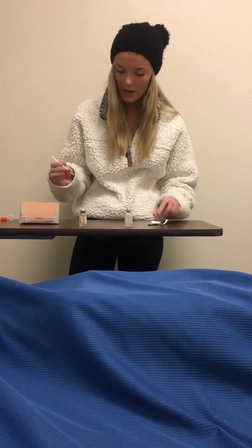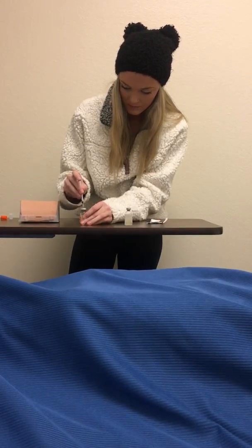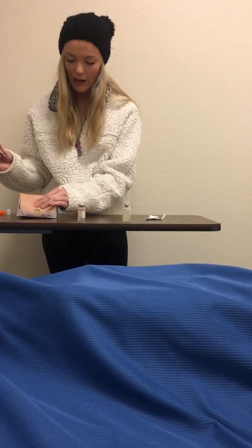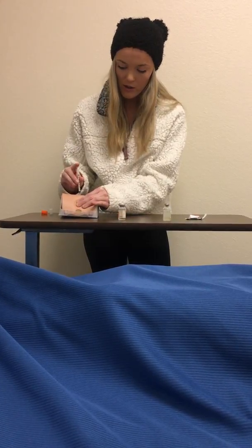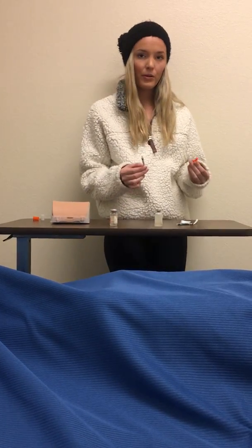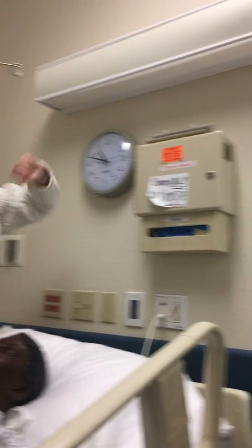I don't want to actually inject this. Okay, sub-Q injection, you're just going to pinch up this inch fat fold, go at a 45 to 90 degree angle, dart-like motion, and inject it. Take it out. Take both of these, throw them in the sharps container. Okay. Then I'm going to document the blood glucose before I gave the insulin. He tolerated it well, and I checked with another nurse. And that's an insulin injection.